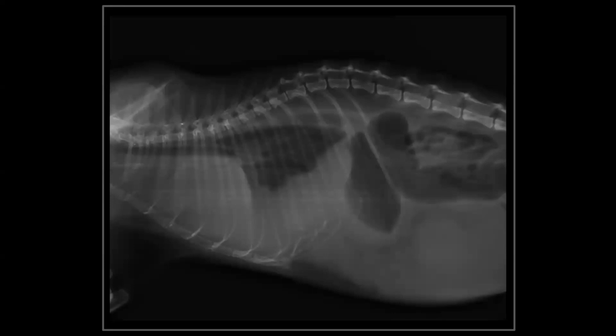But in the severe case, we see the lungs literally floating in a sea of fluid, and there is so much fluid there. It's actually obstructing the major structures in the chest, specifically obstructing visualization of the cardiac silhouette, obstructing visualization of the major vessels. So this is a severe pleural effusion.